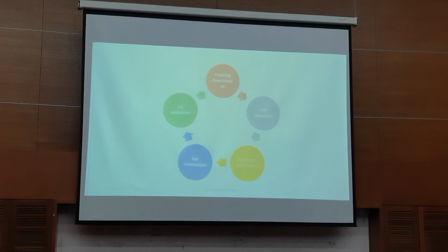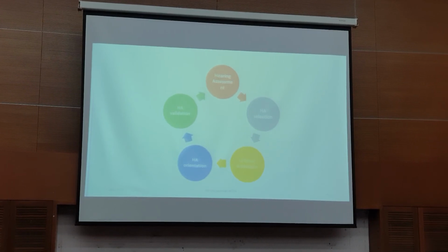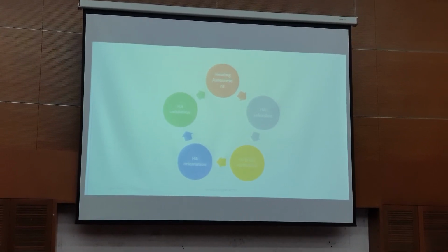Yang ni I just want to say, actually when we do fitting, we have to complete all this. Hearing assessment, of course, you identify this is a candidate. Your hearing aid selection, this is when we select the features for the hearing aids. Features banyak ya, and kalau you realize the price of the hearing aids ada the whole range kan. Kita tak nak bagi semua, tak perlu nak semua the premium punya hearing aids. That doesn't mean they need that, you know. Sebab the more features that you suggest, then it will be more expensive. They may not need it. Again, we consider a lot of things.